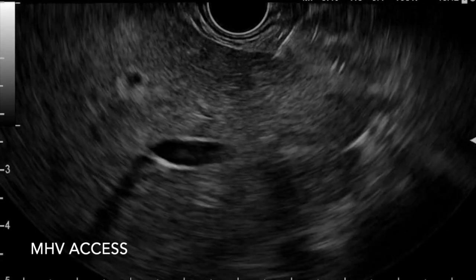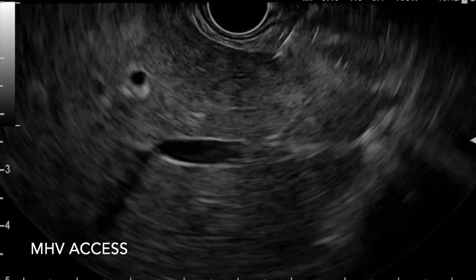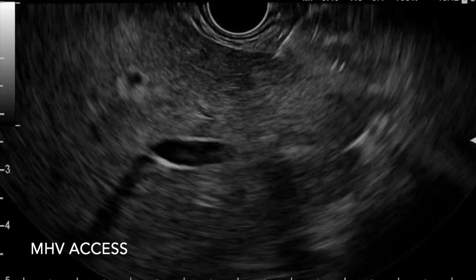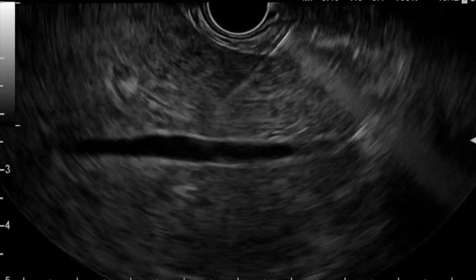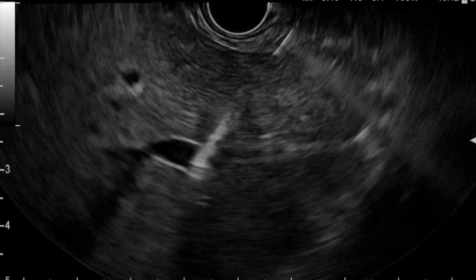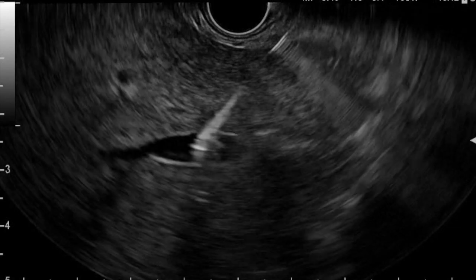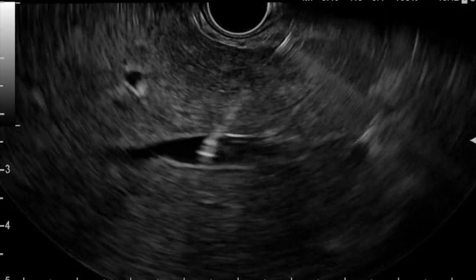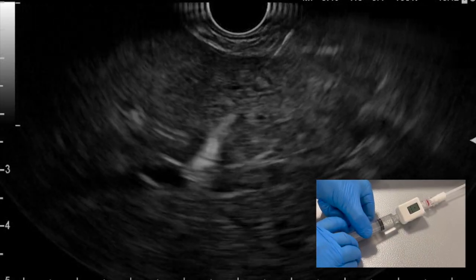If we just pause the video here, one can appreciate the background changes reflective of cirrhosis, a heterogeneous nature of the liver parenchyma, and the liver surface irregularity, atrophy in particular around the fissural planes of the ligamentum venosum and ligamentum teres. Before passing the needle, I check that I'm avoiding any significant varices with the gastric submucosa or indeed the subgastric space.